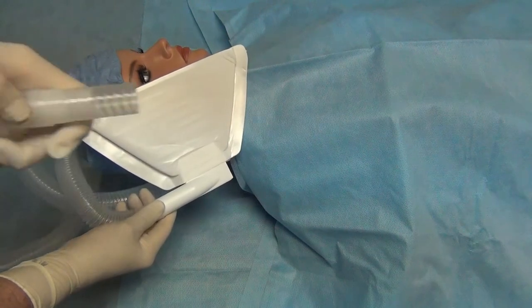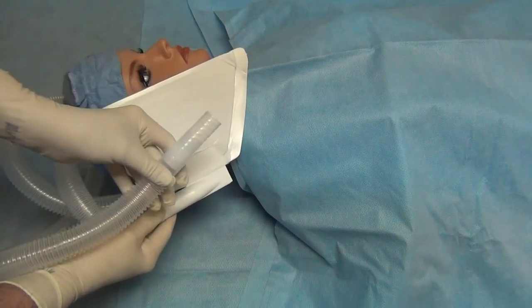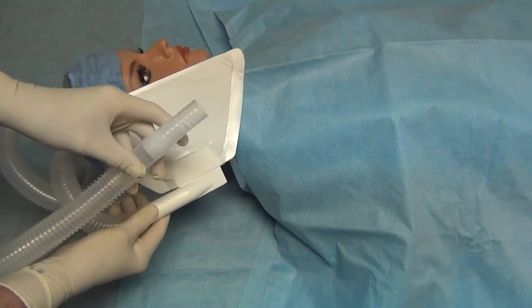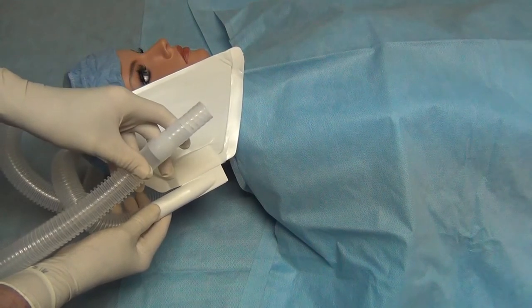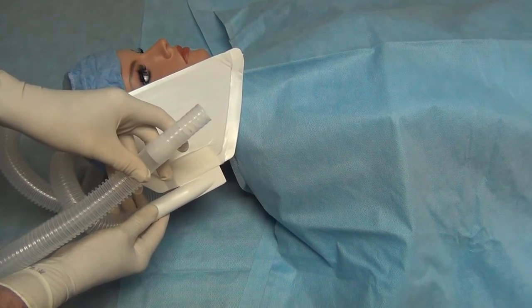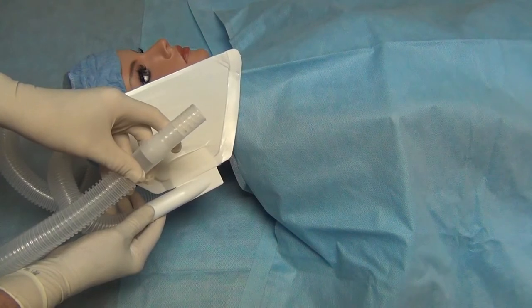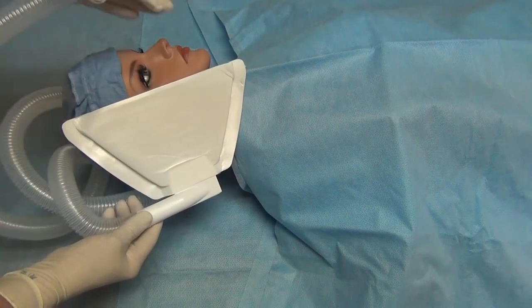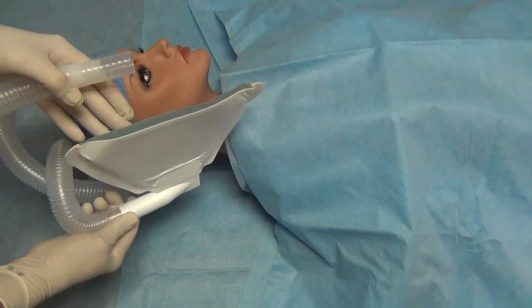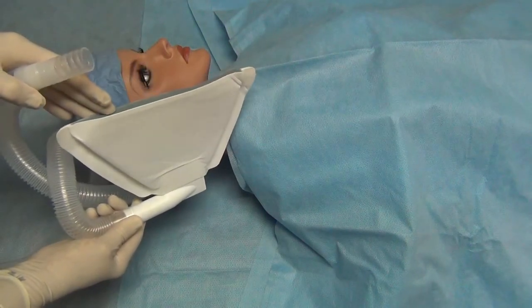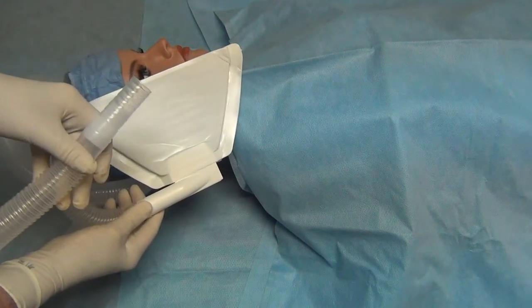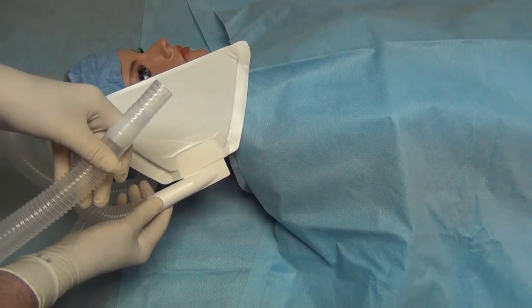The thing to remember is that at the other end of the tubing is the attachment to the smoke evacuator. A bedside smoke evacuator is what you use for the suction to draw the aerosol into the capture area. Keep the smoke evacuator on until the procedure is completed.